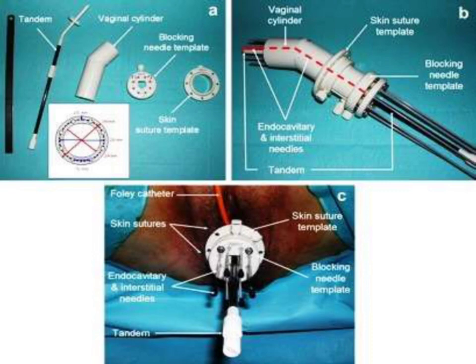Interstitial brachytherapy in head and neck cancer is basically the most ideal situation. Suppose a T2 lesion, a patient is operated and develops a recurrence as a node. If the node is mobile and there is no extracapsular spread, it can be excised.